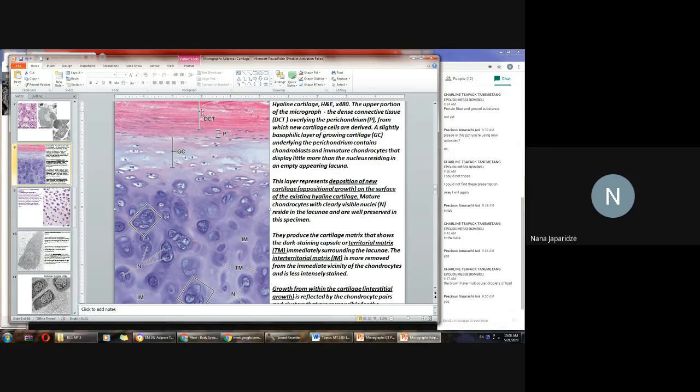So dense connective tissue contains these pink to red stained collagen fibers. Plus you see here profiles, look, this blue elongated profiles. They are fibroblasts, of course. Look, the collagen fibers are clearly visible.